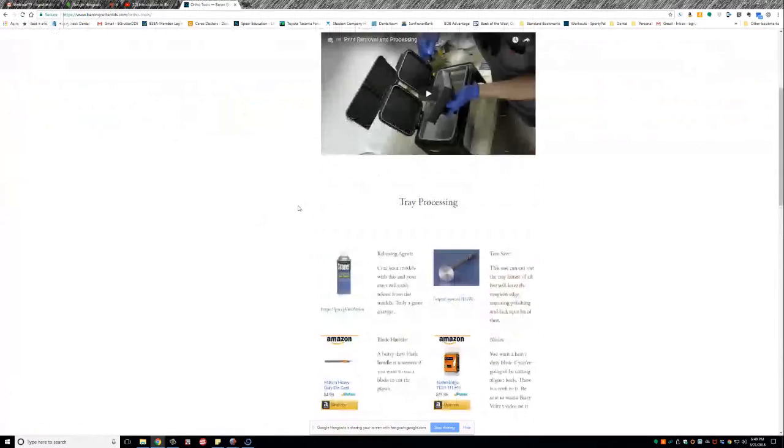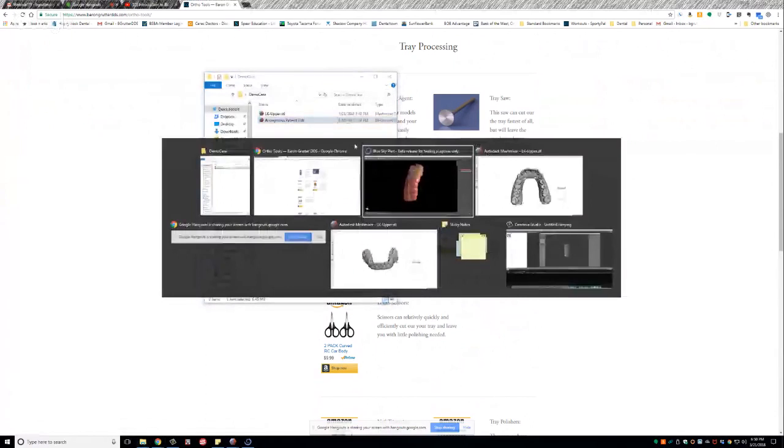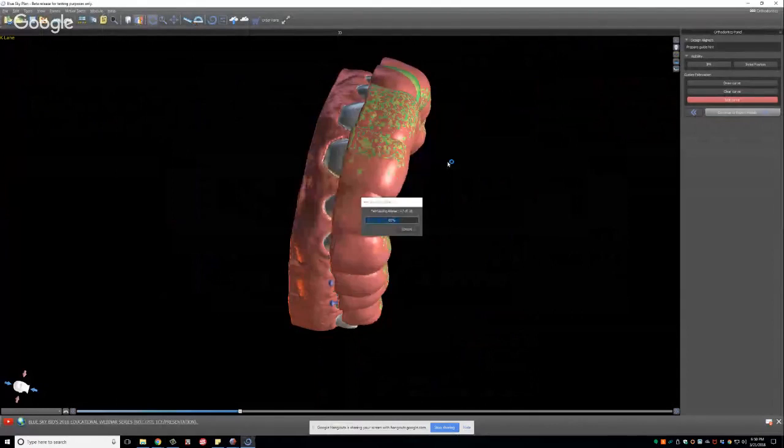For instance, Barry Volts is really helpful online with printing. If you don't want to outsource your printing, he's put out a great video on how to make your aligners, and he uses scissors and a scalpel as opposed to a saw. So there are different ways to do that. It's a big community of people all helping each other. So if you need some of those instruments, it's a free resource for the kind of things I use, and I try to keep it updated.